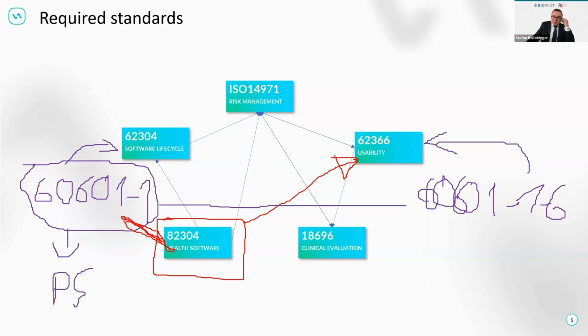The 60601-1 is a bit more complex and very technically described. So for standalone software as a medical device, or software as AI, they're luckily not applicable. However, they are in a few cases very helpful to get the best possible start.